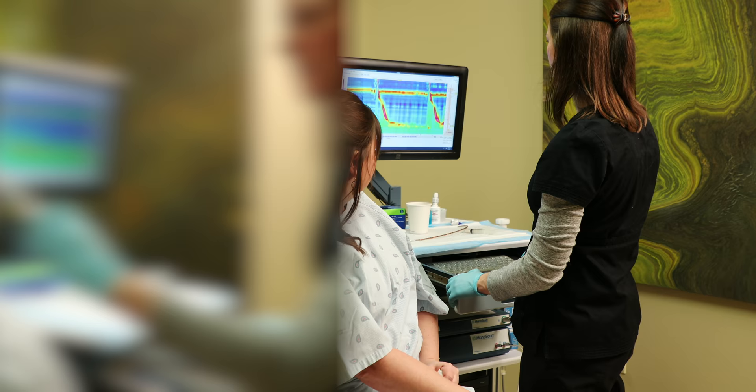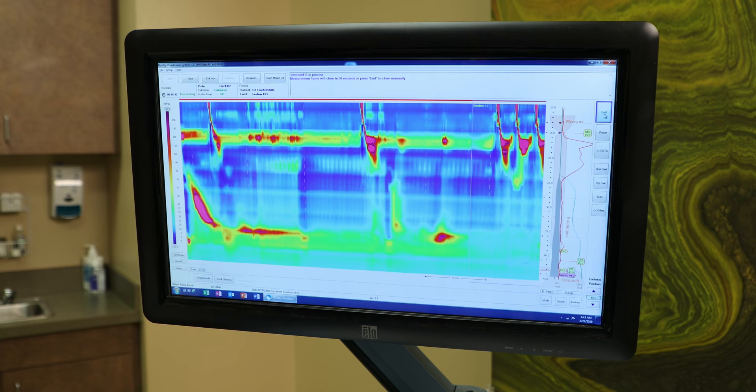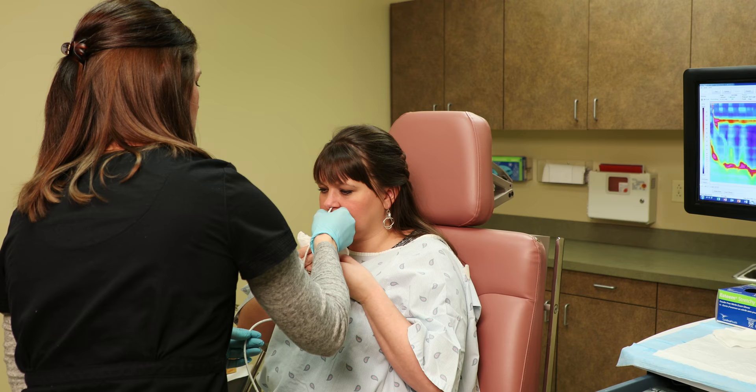At the end of the test, you may be asked to perform additional maneuvers such as a series of rapid swallows, swallowing sitting upright, swallowing a larger volume of saline, or eating solid food. After the nurse has determined the study is complete, the catheter will be removed.